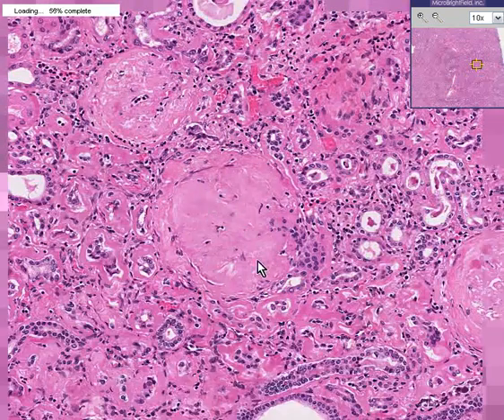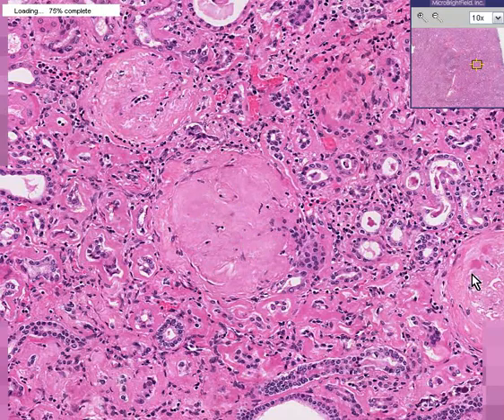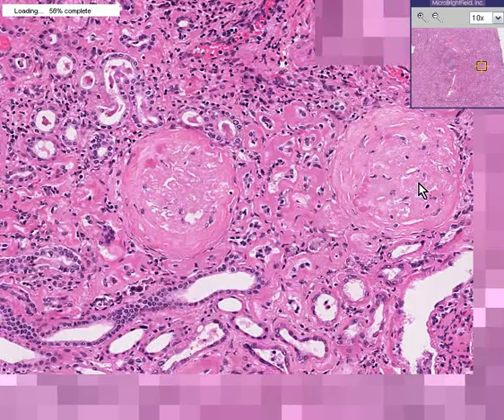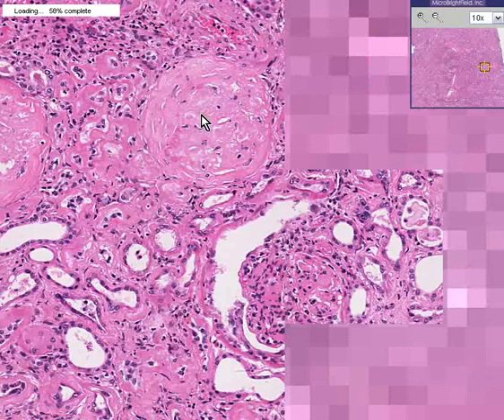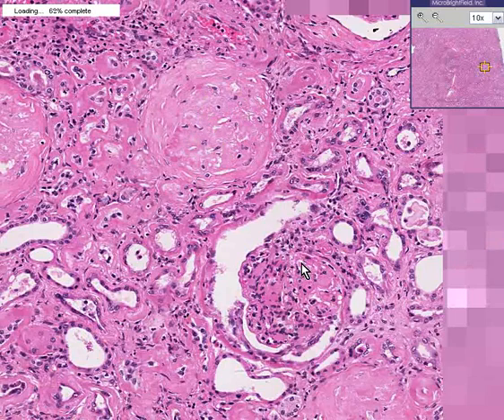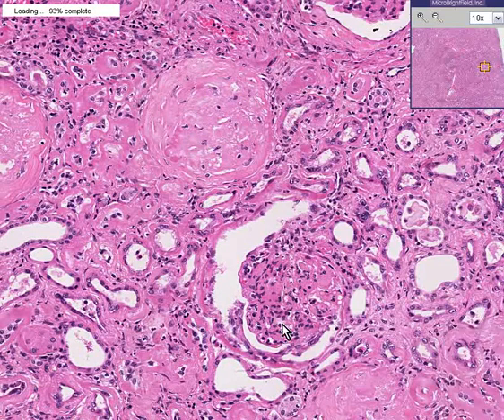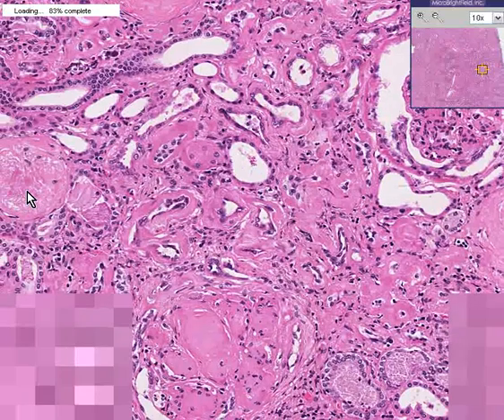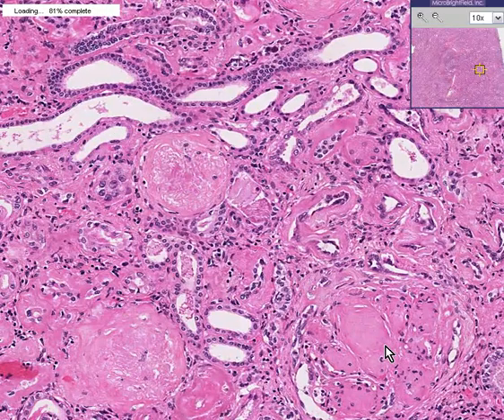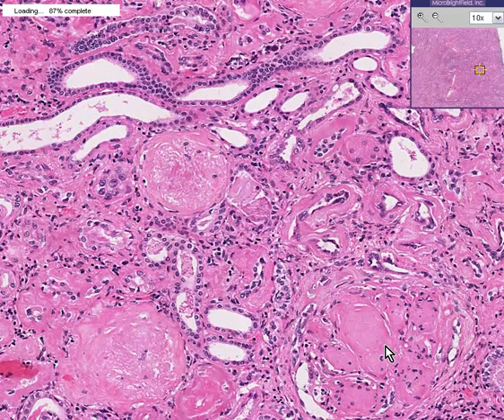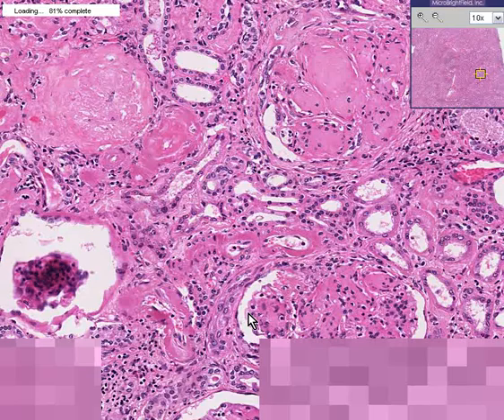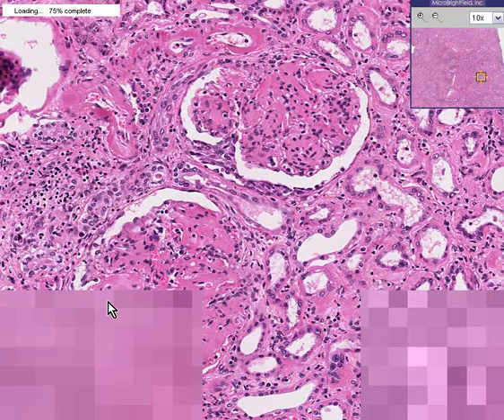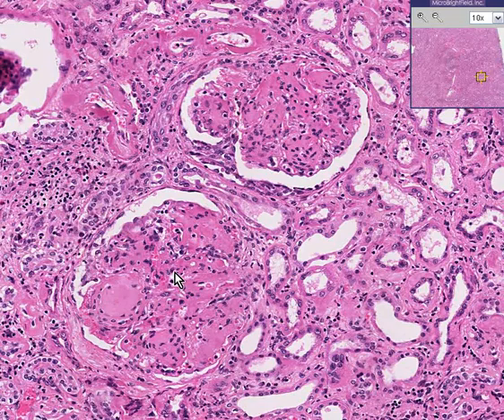Here is a hyalineized glomerulus, and here is another hyalineized glomerulus. Here is one that is not very hyalineized — it is fairly normal. Here are additional hyalineized glomeruli, and here are relatively normal glomeruli for comparison.